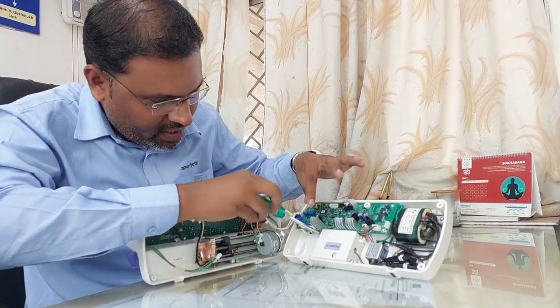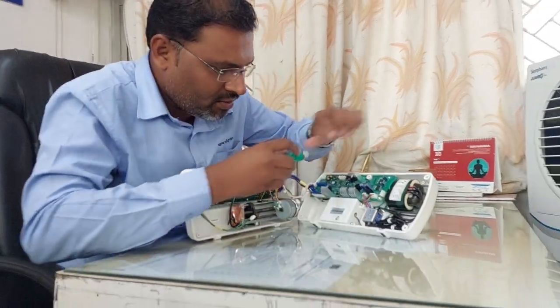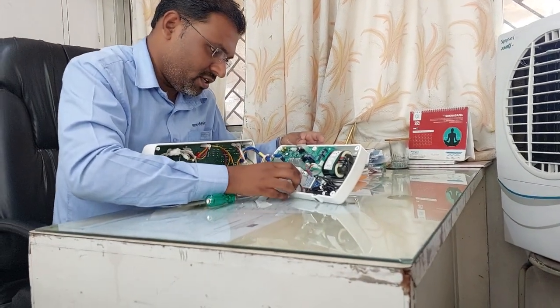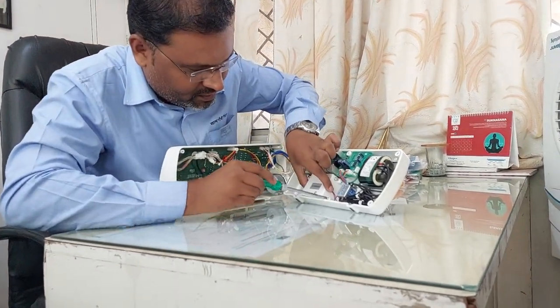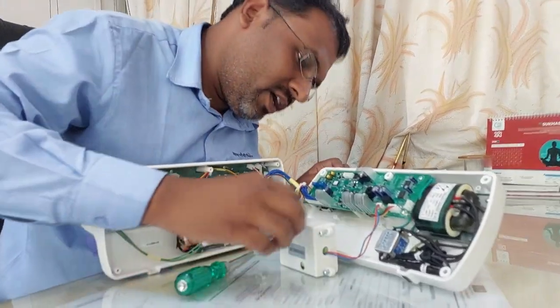When you are working on any electronic equipment, don't touch any component, because due to our static charge, sometimes some sensitive components will get damaged. In this way I have removed the battery.